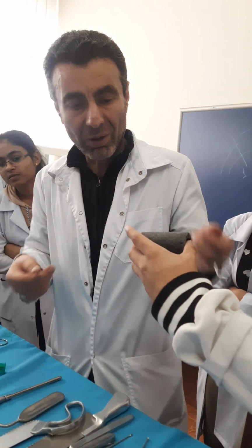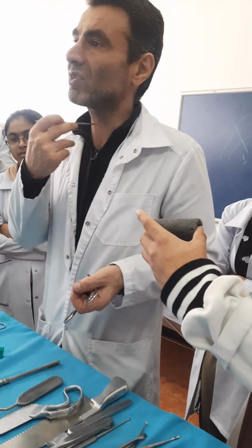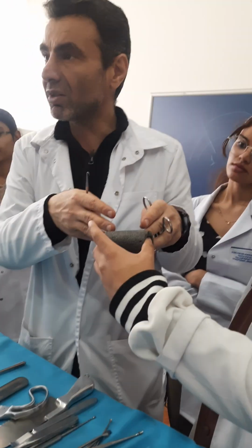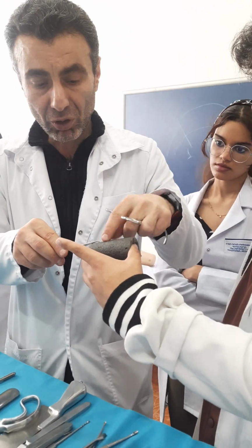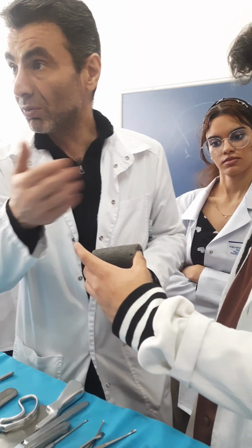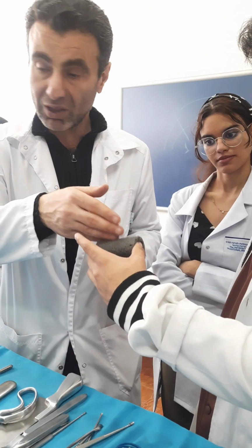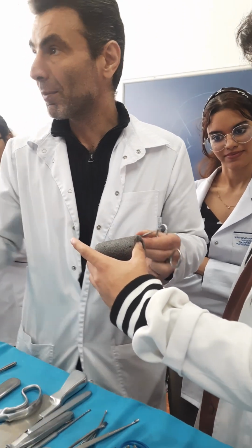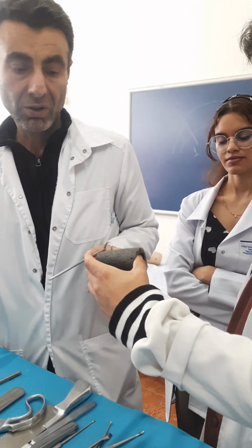Hold it. Now imagine that this is the trachea. I cut the skin, subcutaneous fat first, second first. I retract the infrahyoid muscles. Now I see the trachea. What after? I take two hooks, one above and one below the place of future incision. Why is it necessary? To prevent any movement. If without fixation of the trachea you try to cut it, you will damage the carotid neurovascular bundles, which are located laterally: common carotid artery, internal jugular vein, and nervus vagus between them.